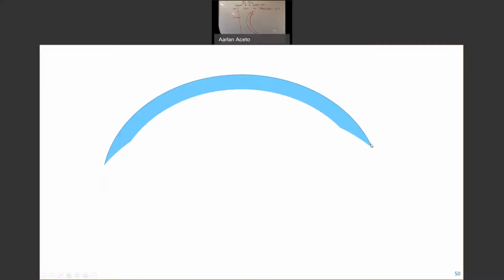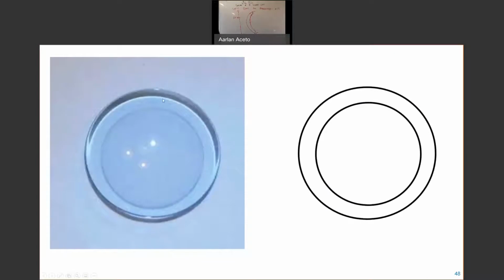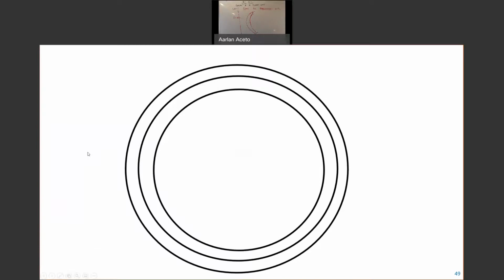So what you're looking at when you're left with it, you've got this part of the contact lens, so this is my optic zone, and you've got these peripheral curves. If you looked at it face in, this is what it sort of looks like from the front. So if you can imagine, from top to bottom is what's called the overall diameter. From this line to this line is your optic zone, and I can tell you how wide it is, the optic zone width. You have the overall diameter. And then these little areas here, this is where we have those posterior curves.